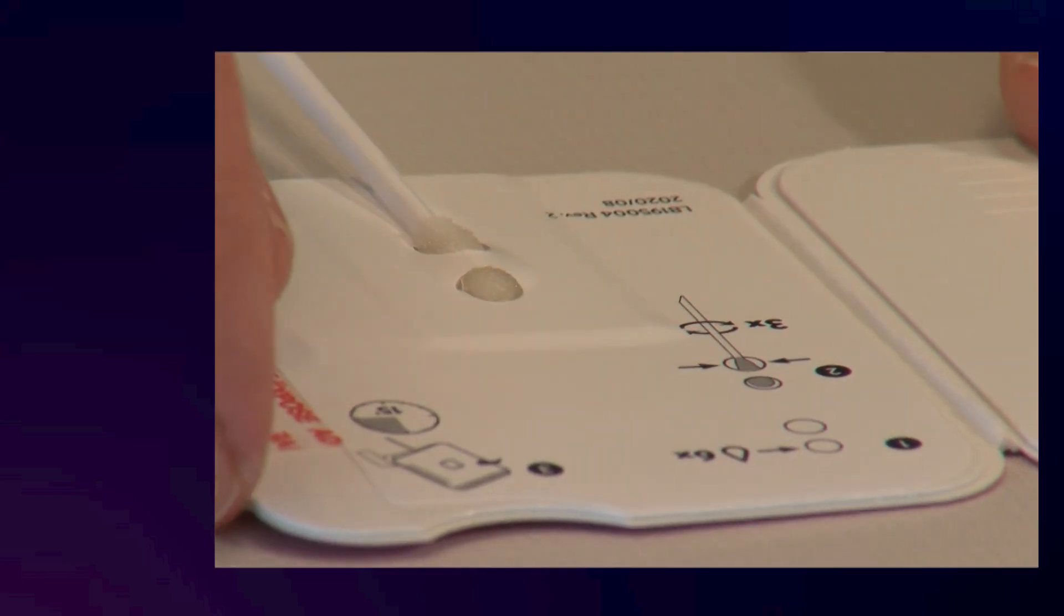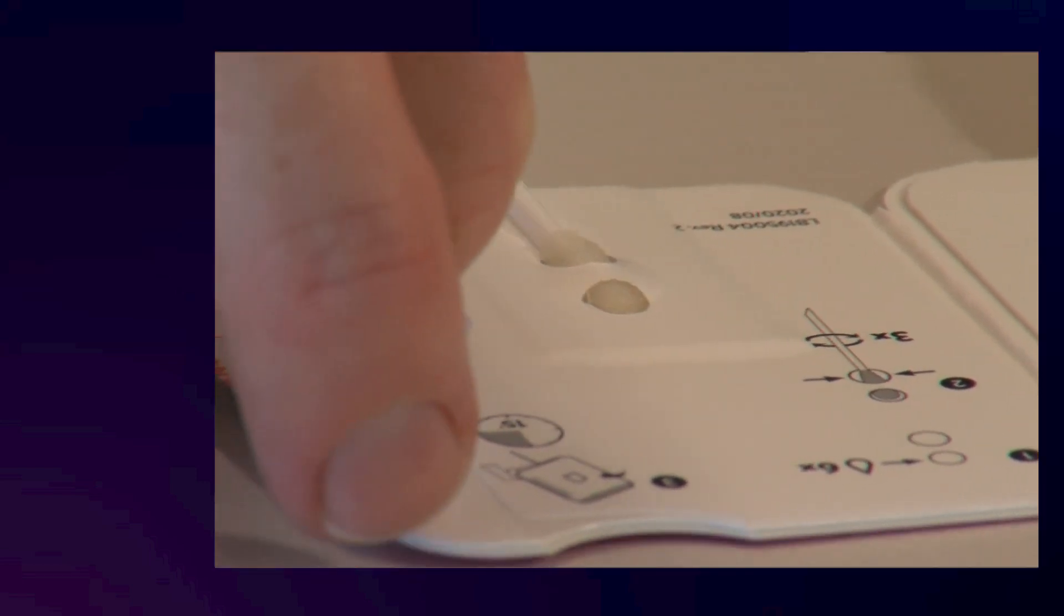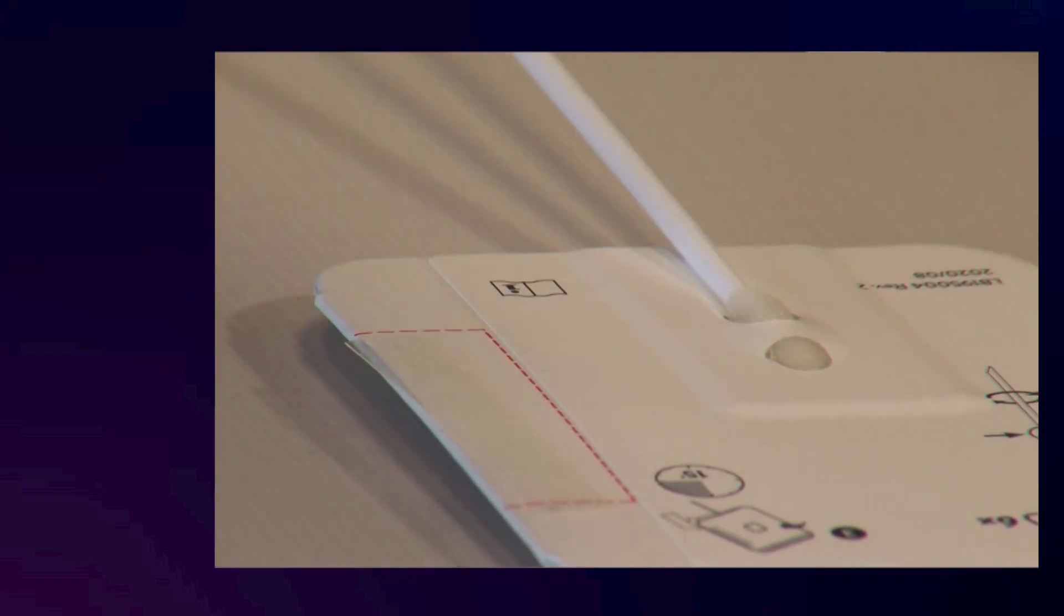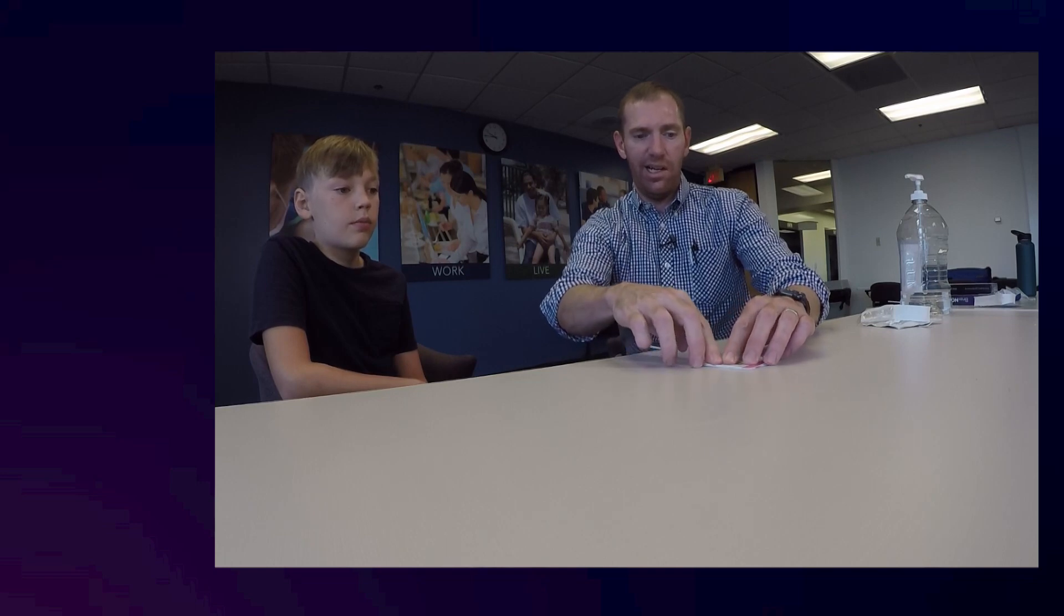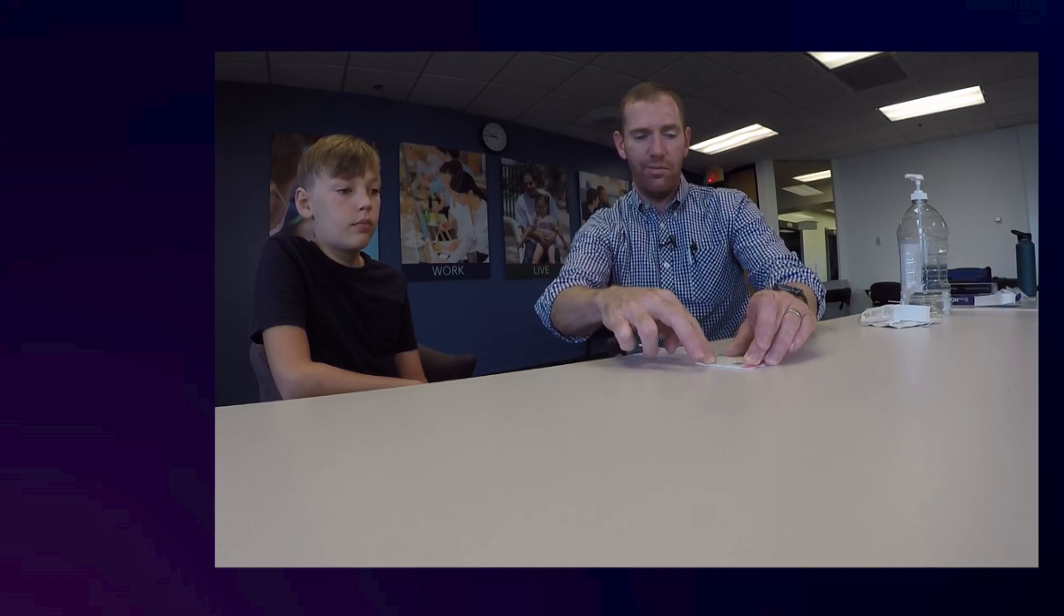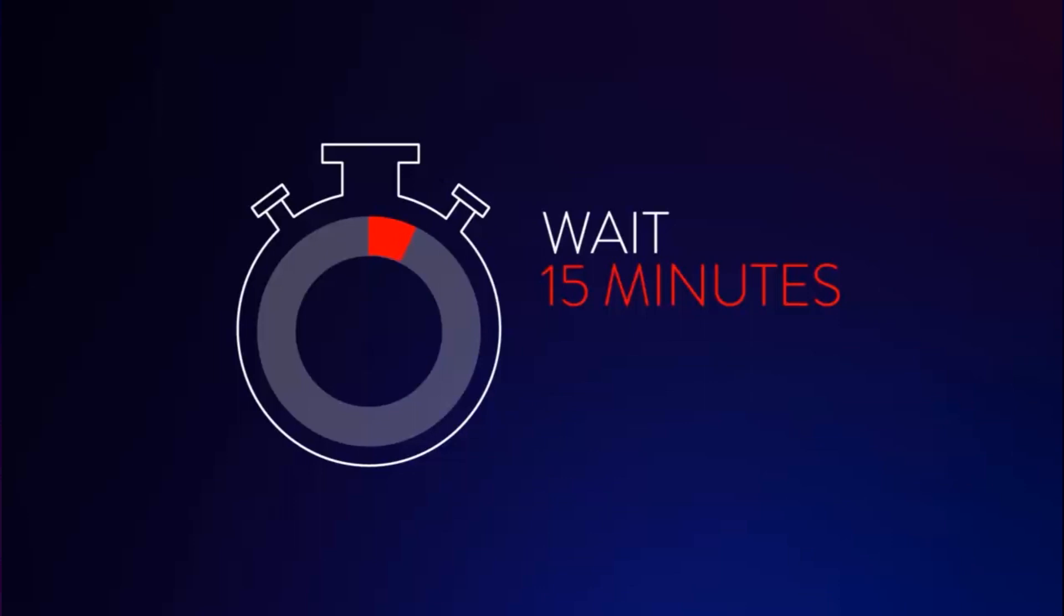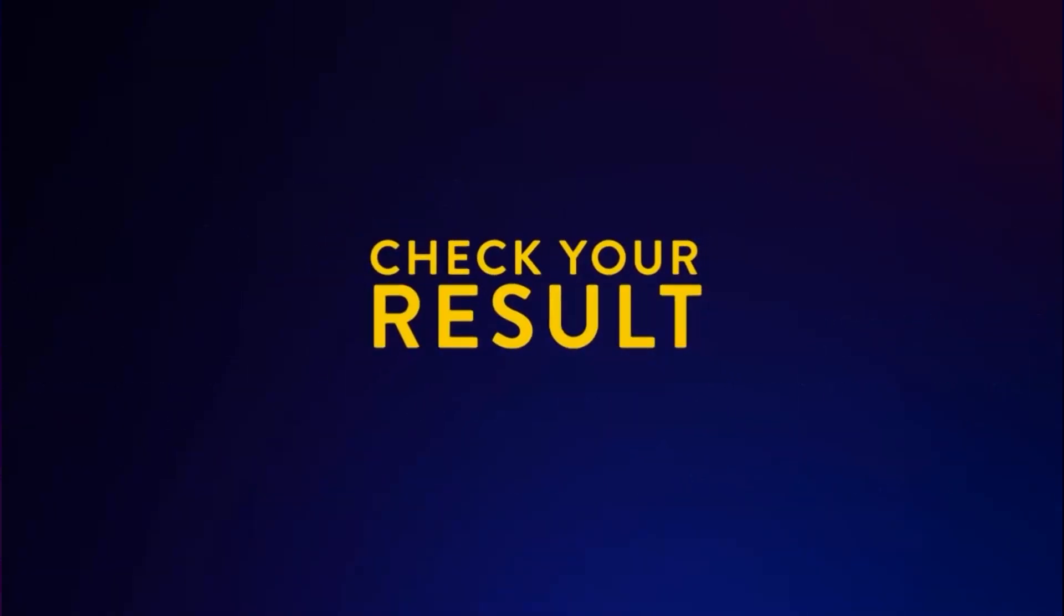You're going to leave the swab in place, peel the paper off of the adhesive on the card, and fold the top lid of the card over, sealing it on that adhesive strip. And once you've done that, you just leave it for 15 minutes while we wait for the results of the test.